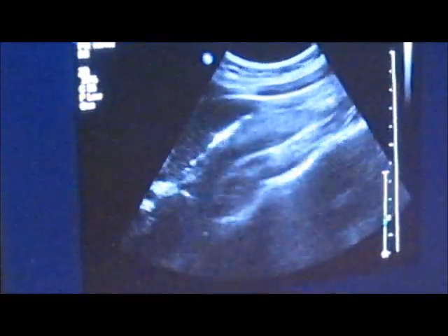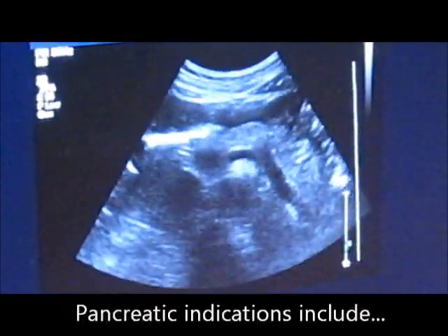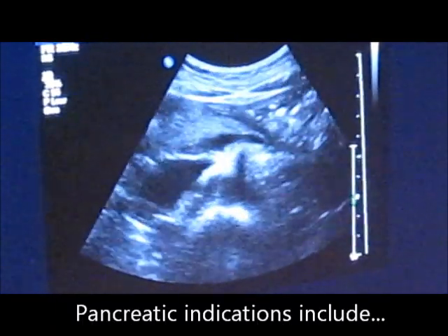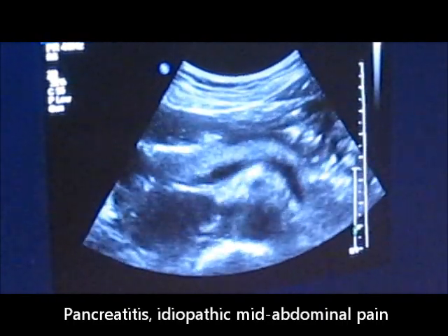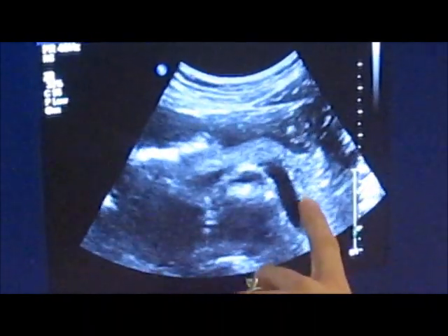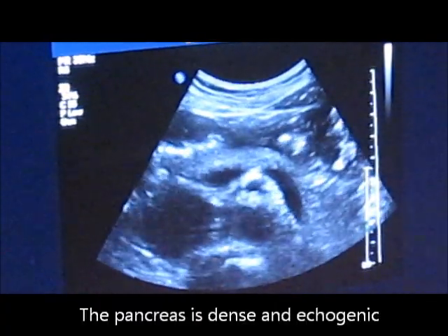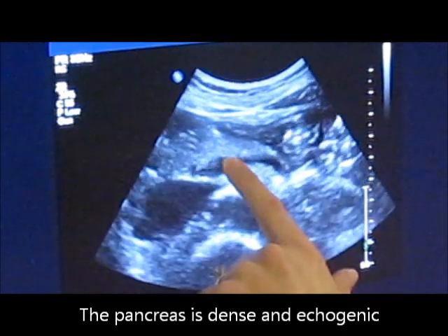The next from there is I normally look for the pancreas. A patient that has possible pancreatitis, they may order an ultrasound, which is when they're having mid-abdominal pain. We have the pancreas here. It's pretty bright looking on the screen. We call it echogenic, so it's just going to be brighter than the surrounding structures.